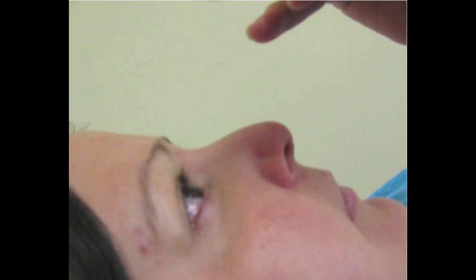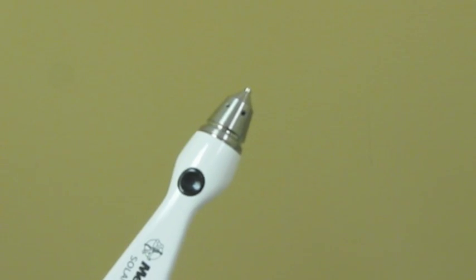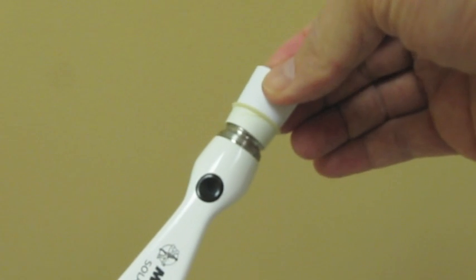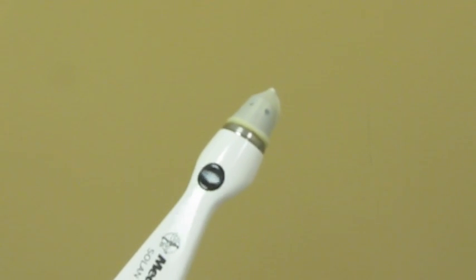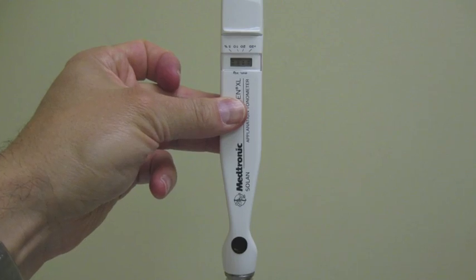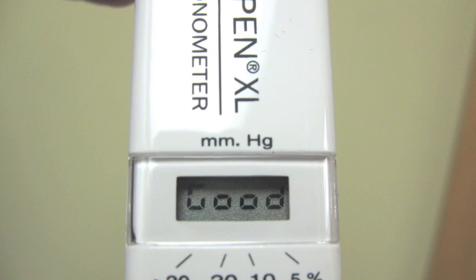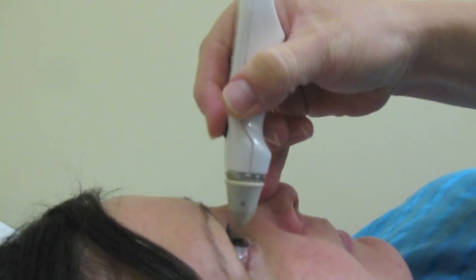The patient can be lying supine or be in an upright sitting position. Ask the patient to stay relaxed, not to blink, and to stare at a fixed spot on the wall. Use a new covering tip on the tonometer — roll it down and remove the paper base.